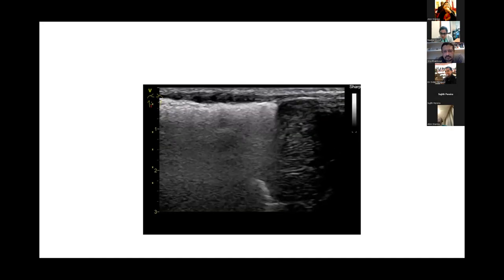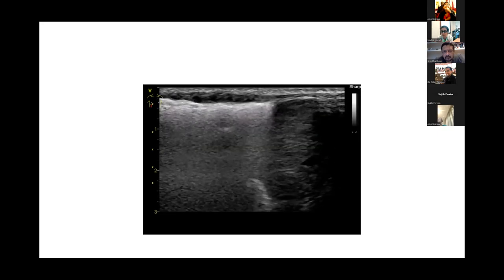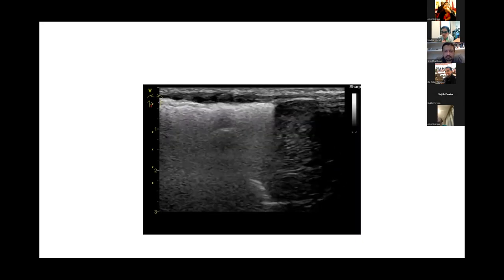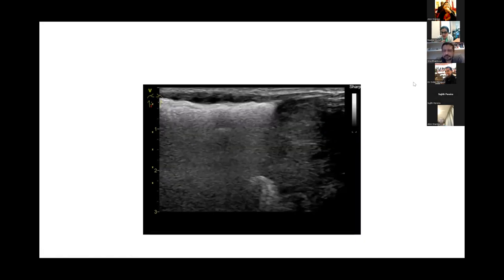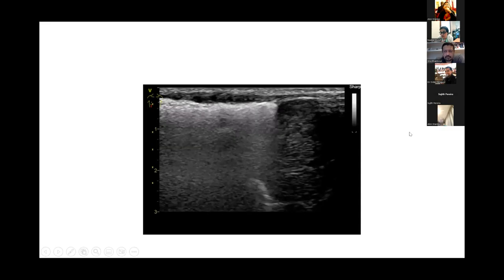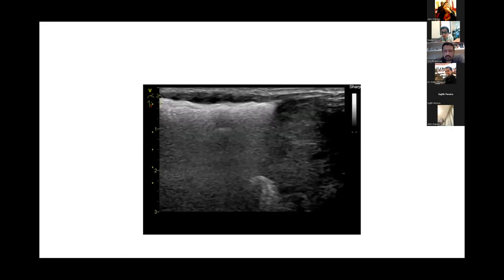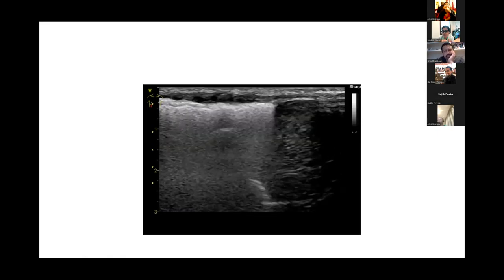So the fact that you do not have any, at least in the clip you're showing us, and maybe if you move the probe, you will see it somewhere else. That's possible. But in this clip, the pleural line is irregular, but there is no shred sign. It's continuous. Yes. If you had had a break in your pleural line, then that would have been a probable diagnosis. But here we don't have it. So we don't really know either. Either it's an A-line. Yeah. Or not. And I'm sure when you scan the patient, you were able to look. So when you do that, you'll be able to assess for that.